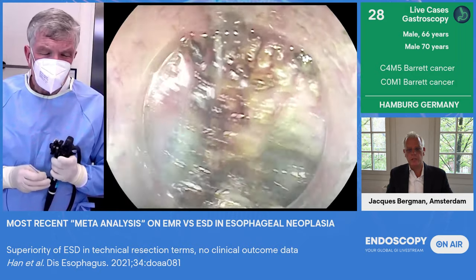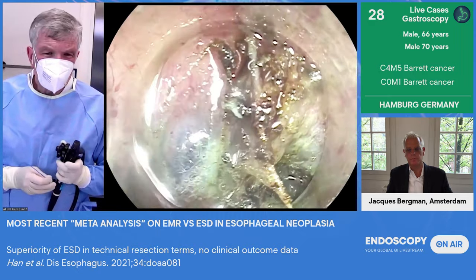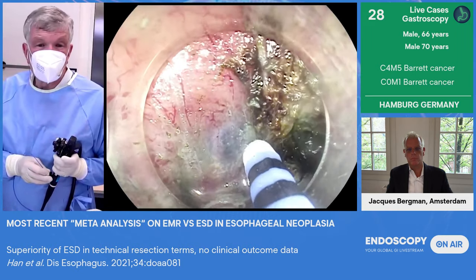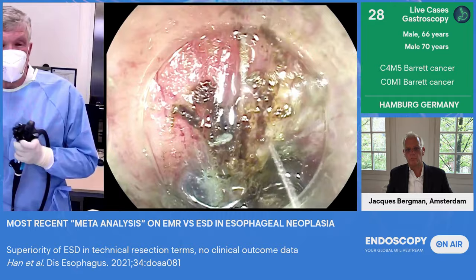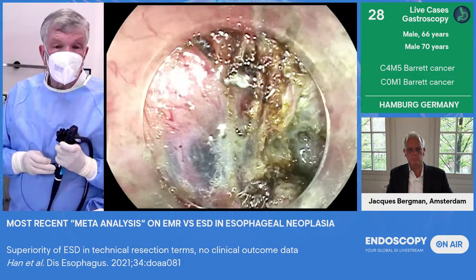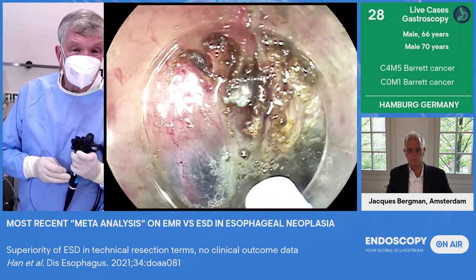Thomas, we're back with you. You've changed the knife. Yes, we wanted to show you, of course, you can work with different knives. That's the knife from Erbe, where you can also do injection. As you can see here, it's blowing up. So we have shown you several ways of injection. The lift up is still there, but you can add some other fluid with the other knives.